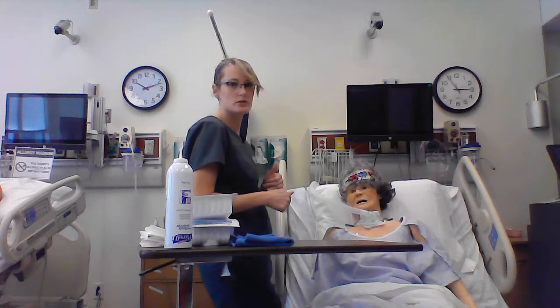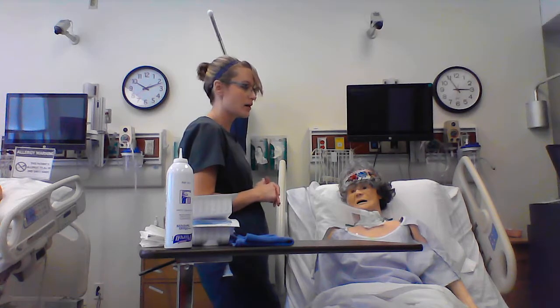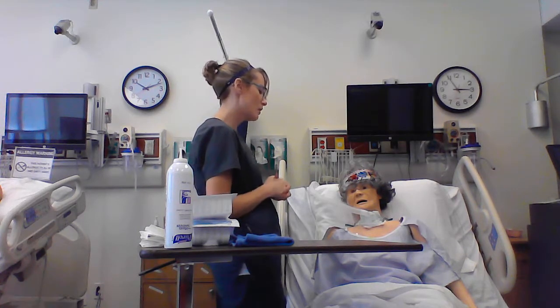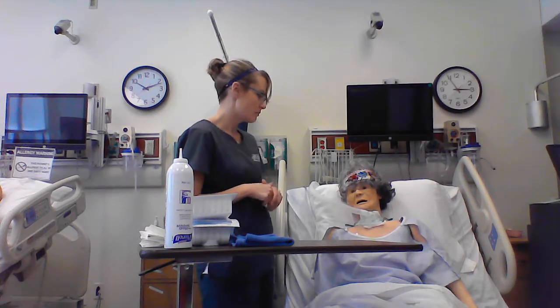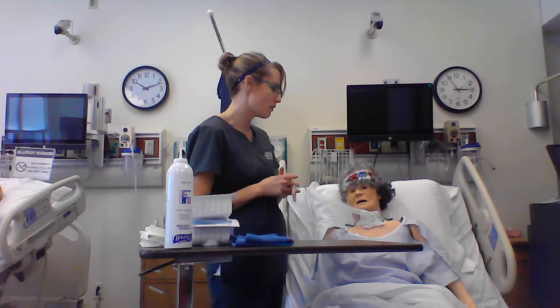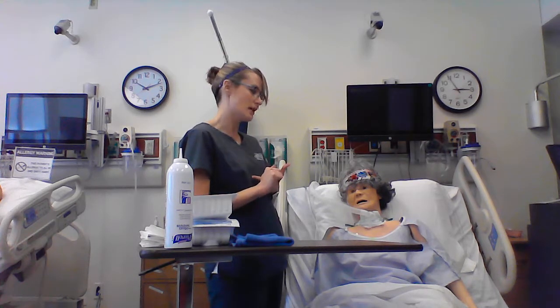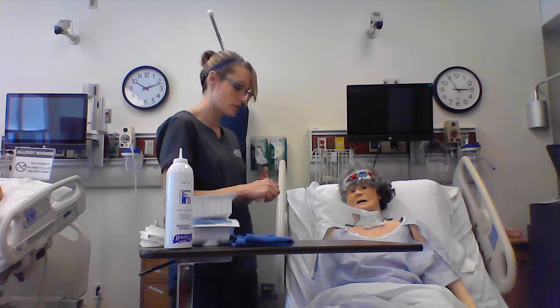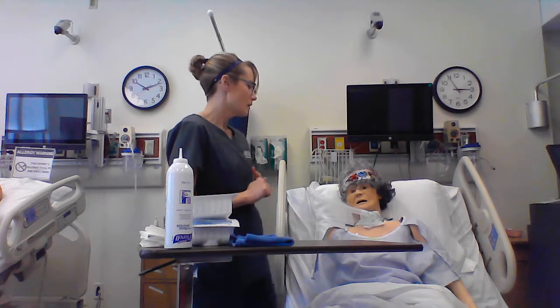And then I want to take my stethoscope and listen to her lung sounds, see if she has any adventitious lung sounds, rhonchi, rales, crackles, if she's wheezing, just to assess whether or not she really needs to be suctioned, and she does. Miss Opal has had a trach for quite a while now, so she's familiar with the procedure of suctioning and trach care, but if you had a patient that had a new tracheostomy, you want to explain those to them so that they can consent to the procedure being done.